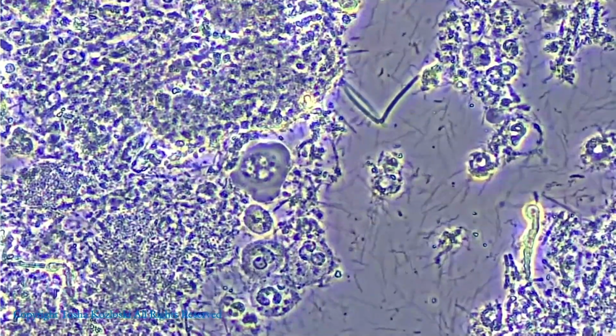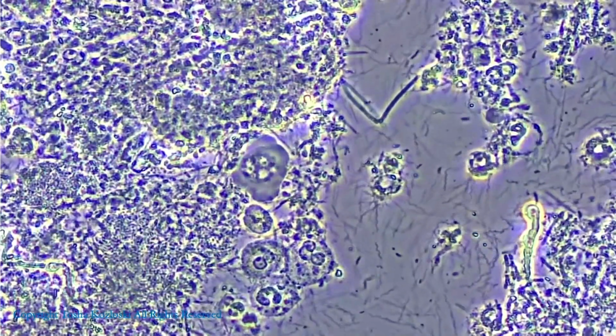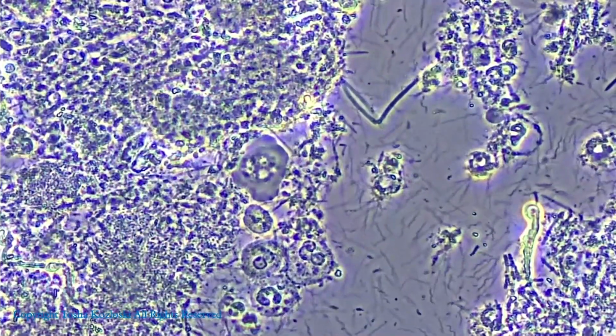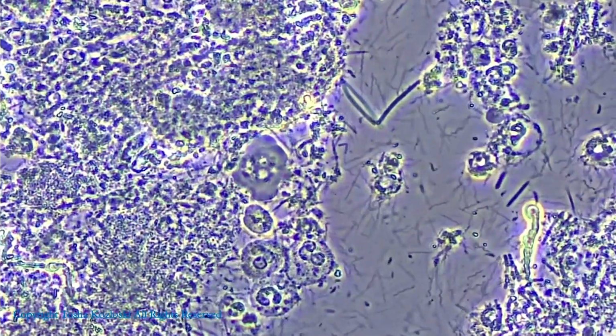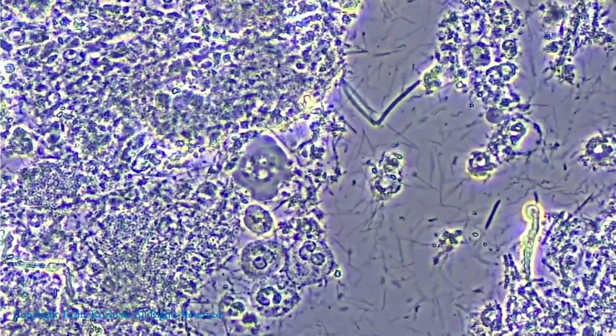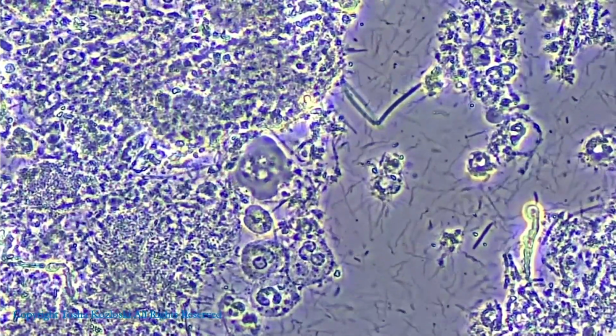And so this is her microscope slide. This is the one that we looked at a little bit earlier on that other slide, but as you guys can see, it's just an all-out war in there. And remember, she has diabetes as well, so we know that patients that are diabetic can be up to 3 times more likely to lose bone faster than somebody that's not diabetic. It's such a two-directional relationship.